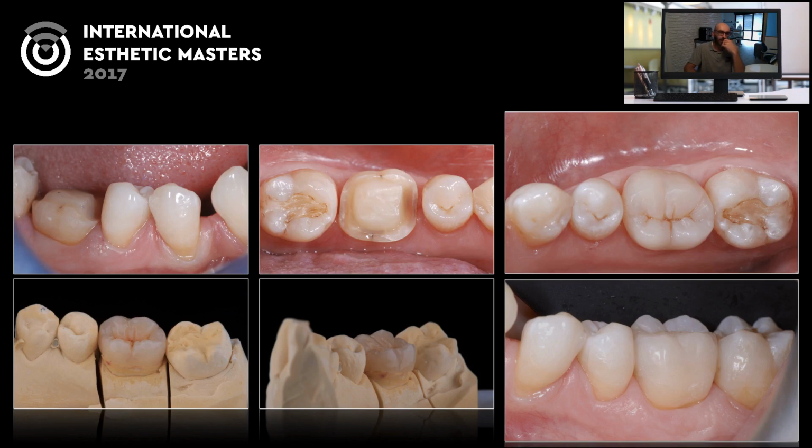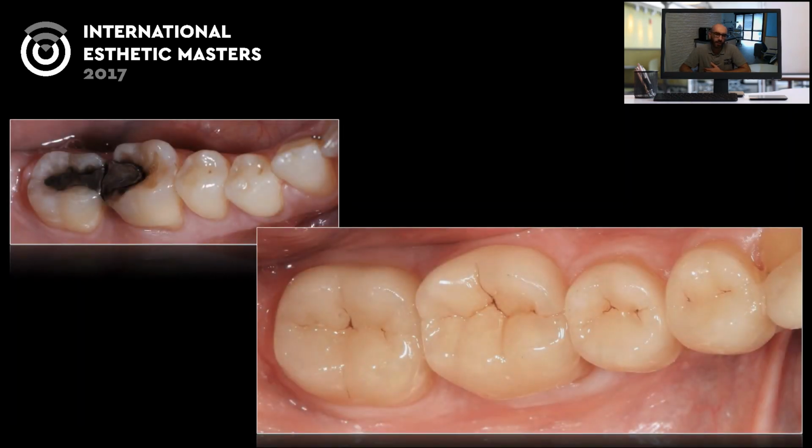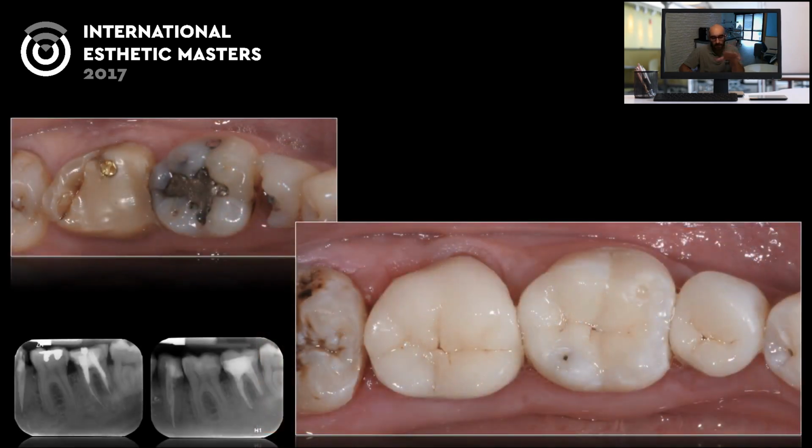Just a few samples of what we can do with this composite restoration. In our laboratory we use composite especially for inlay only, or when we have some big implant cases where someone on the implant still won't use ceramic but composite, because it has a shock absorber effect. So this is just a few samples of reconstruction of teeth made by composite, and here again two molars. We made these inlay only, not with the press technique. We made them with a spatula, in the traditional way.